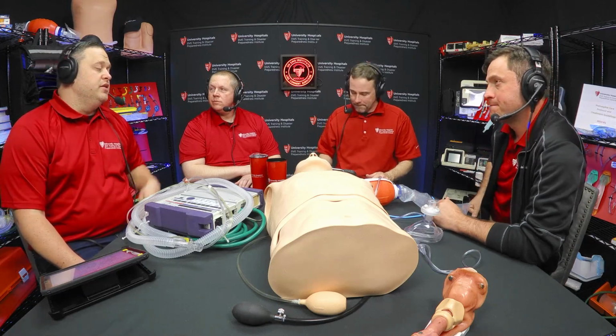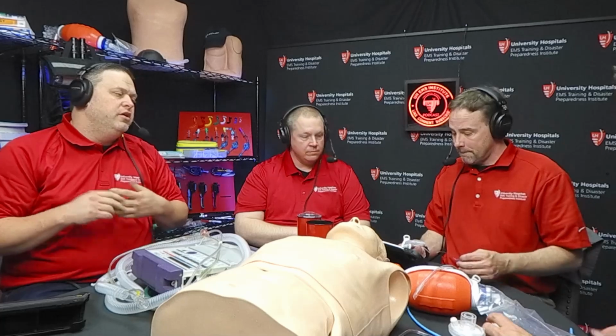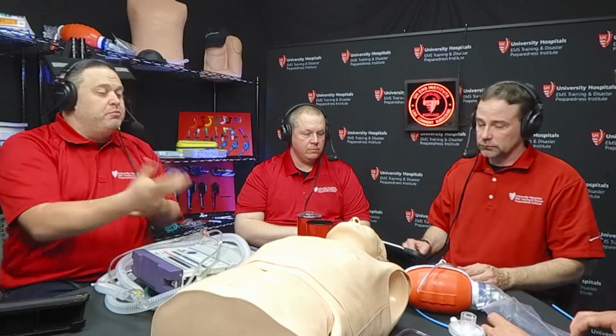But I'm also going to say, just by replacing that device, a lot of the times it's just the device that's broken, right? And that could be for a number of reasons. As we said, the cuff's down. You could have a mucus plug in there. It just could be blocked. Just by pulling it out and replacing it with a new one, you might just fix your problem.